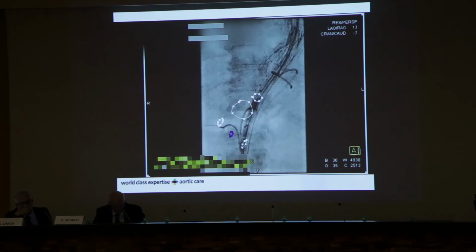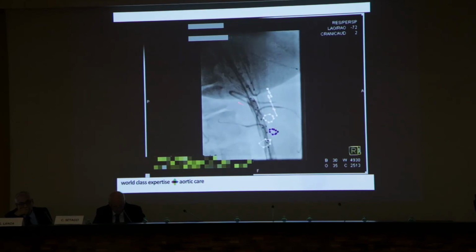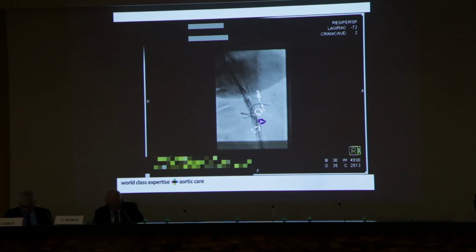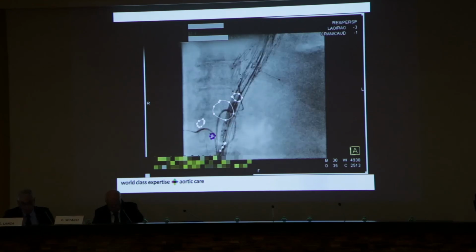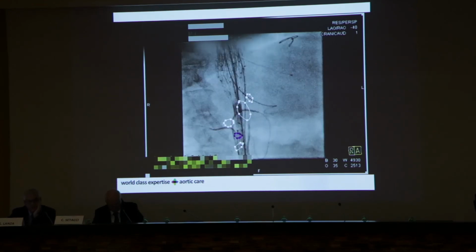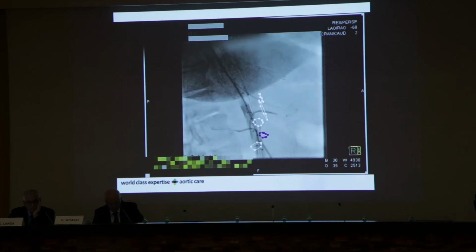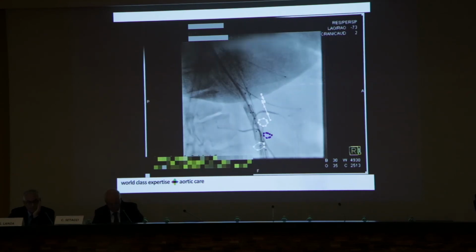So you notice that the graft, the main body, is still constrained, and yet we're taking the time to get the celiac artery and then in succession the SMA and the right renal artery before the graft is fully opened. This gives us the ability to actually twist the graft intraoperatively if we need to line up each fenestration individually in a far more defined way.